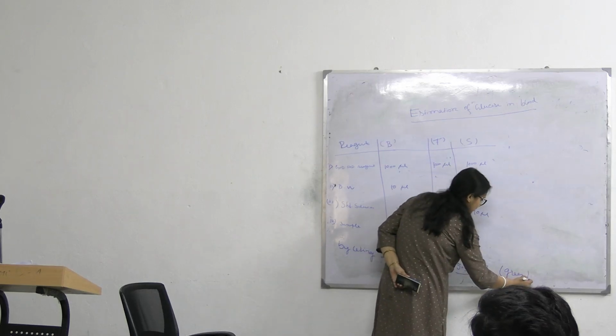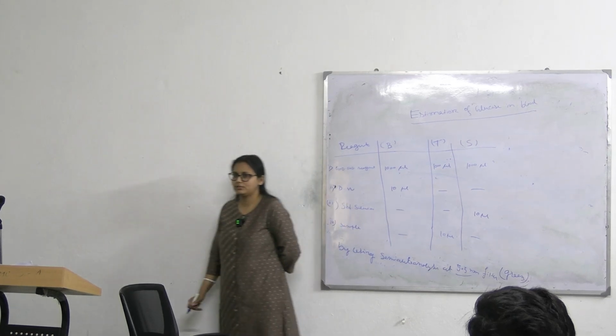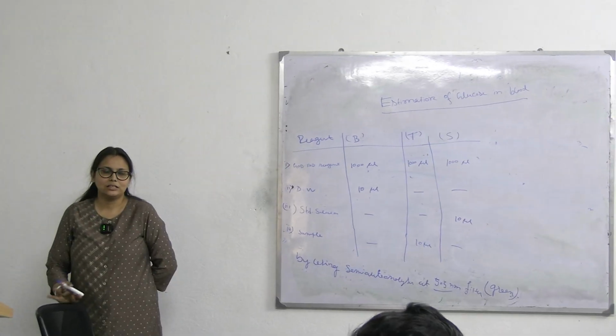Green color. Why we are using green colored filter? From your colorimetry class, green color filter is used here.